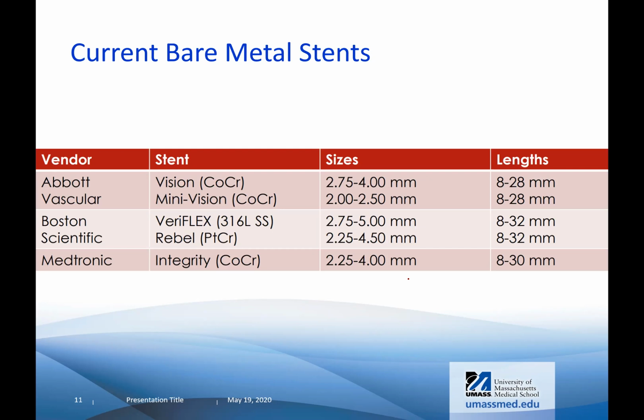Although there are a couple of trials now by the Synergy group, as well as by the Onyx group, which is Medtronic, showing that with 1 month of dual antiplatelet therapy, you can stop one antiplatelet, the Plavix or the ticagrelor, after 1 month and keep them on aspirin. And the risk of stent thrombosis is very, very little in those, below 1%. So bare metal stents are kind of phasing away, especially if you're putting a large Synergy stent. The risk of stent thrombosis is very little.